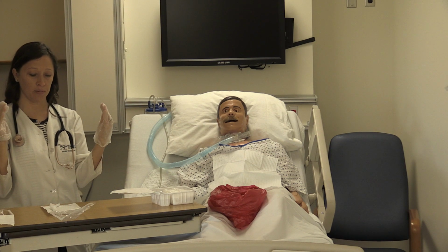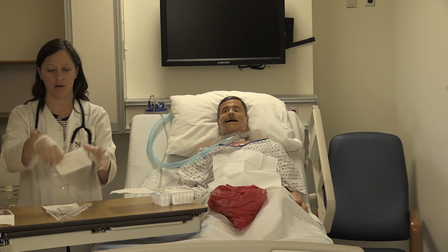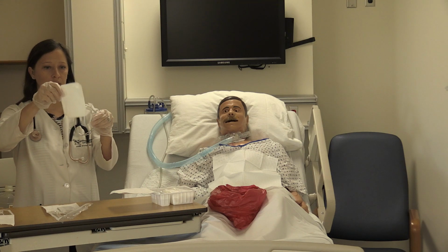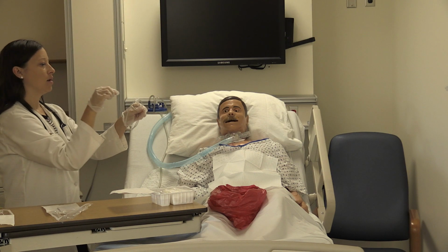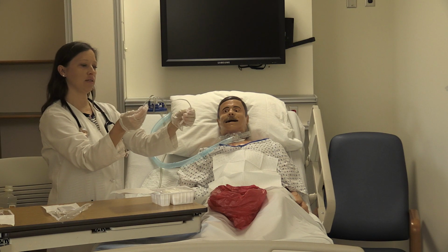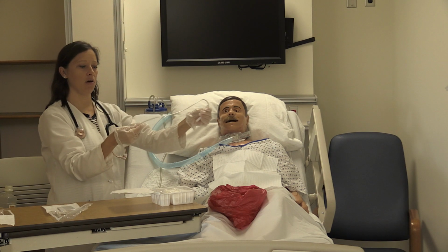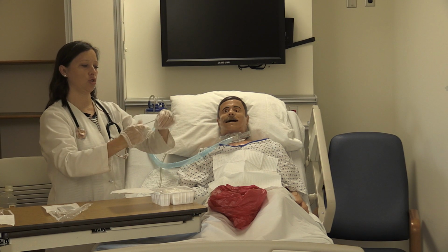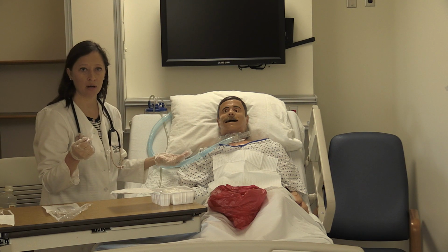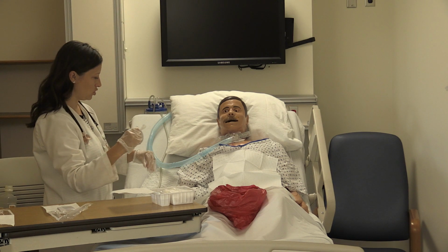The last thing you need to pick up out of your sterile suction kit is your actual suction. So you want to pick this up and just get rid of that. You want to keep the tip of this sterile. Yes, my oxygen is at 100%, by the way. You want to keep this tip sterile, and you want to twist this up in your right hand. And now with your left hand, you're going to say that you're going to contaminate it because you need to connect your suction catheter to your suction tubing.